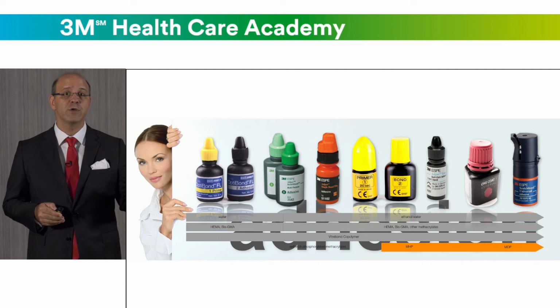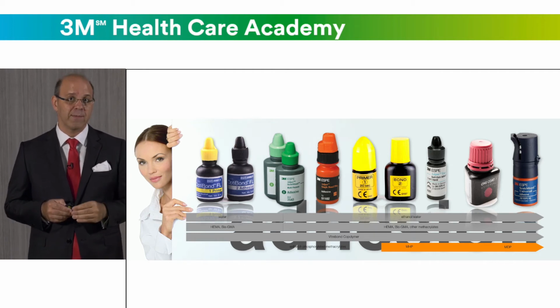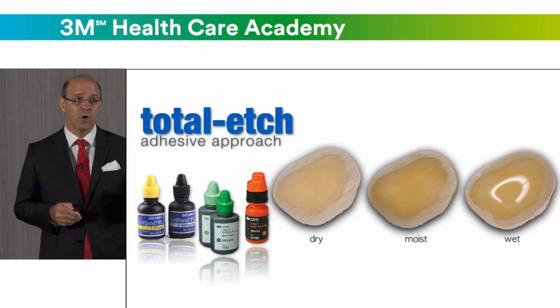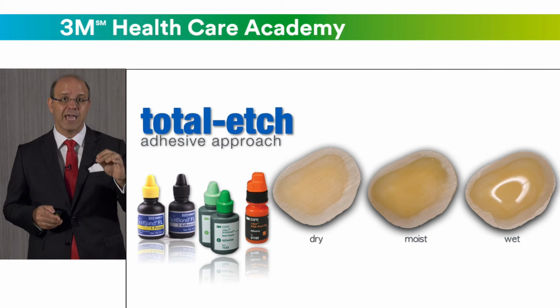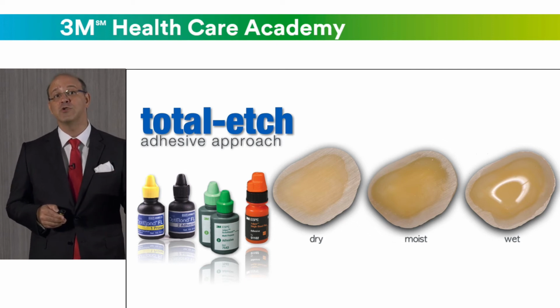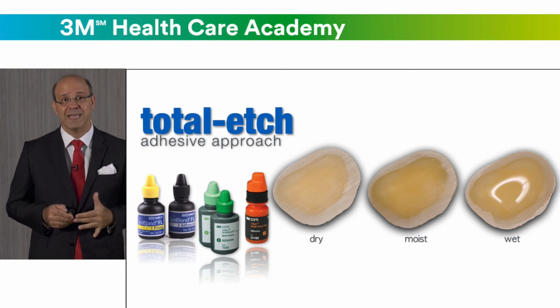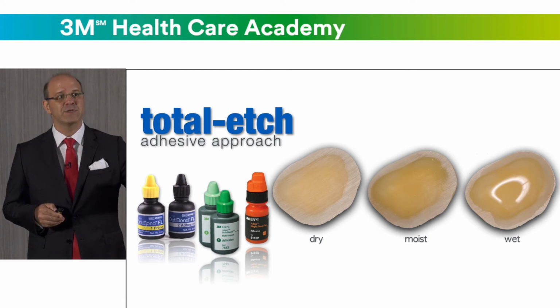No matter which one you use, you should use it in a proper and correct way. For example, total etch 3-step or 2-step adhesives are not so tolerant of moisture in the dentin. So don't dry the dentin too much, and don't leave it too wet.